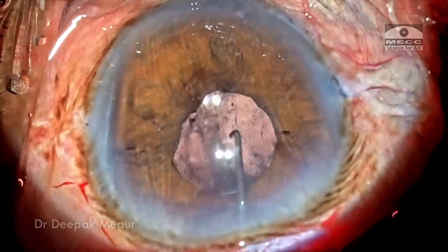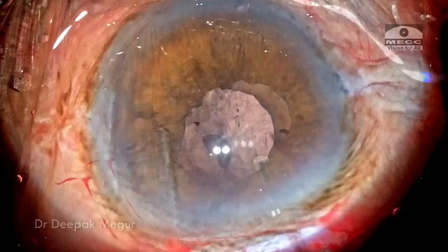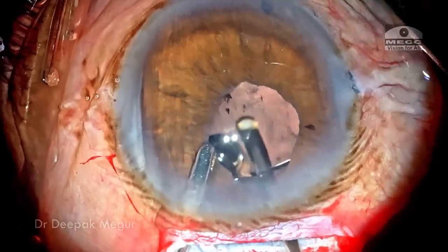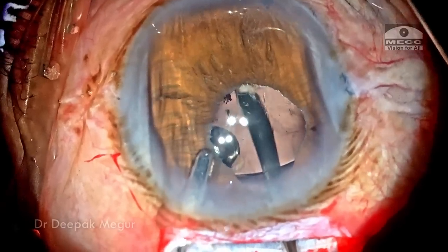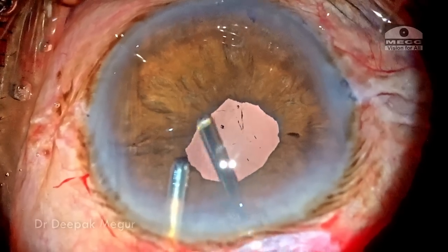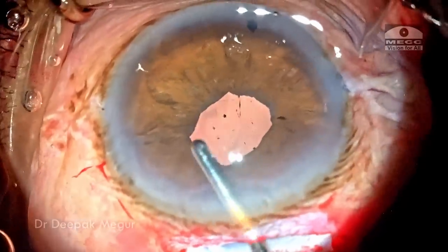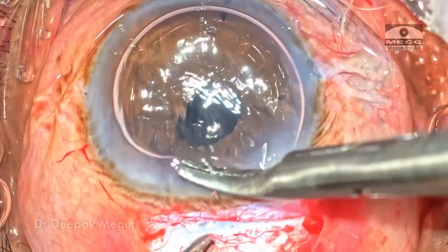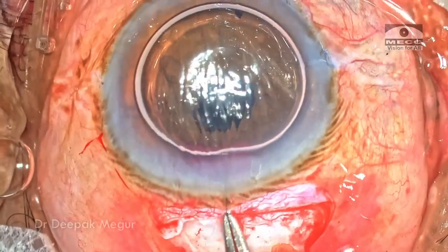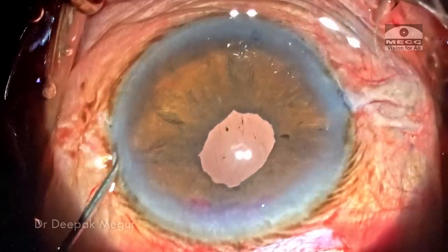I'm using a Sinski hook to nudge the lens around and ensure it is truly stable. I then go in with the cutter just below the lens to remove all the OVD and any debris which has entered into the vitreous cavity — in a couple of minutes it's all clear. Now I'm going to remove all the OVD which is in front of the lens. Time to close. Since the patient had against-the-rule astigmatism of about 1.5 cylinder at 100 degrees, I'm going to use a single radial stitch to counter this, and the knot is nicely buried into the sclera. The air bubble is aspirated out, the side ports are hydrated, and intracameral antibiotics are placed into the eye.